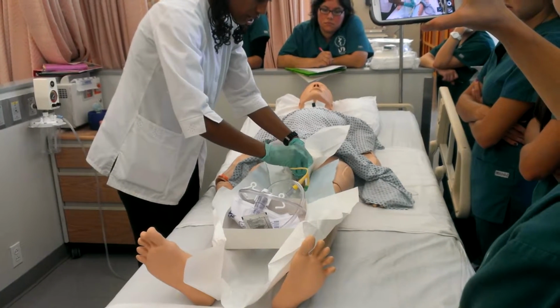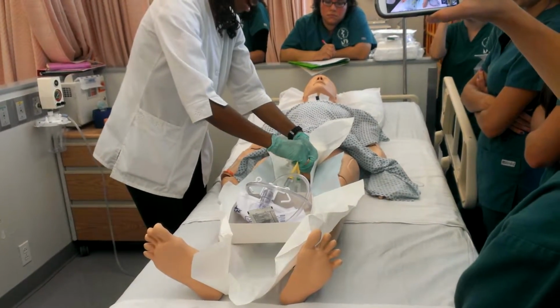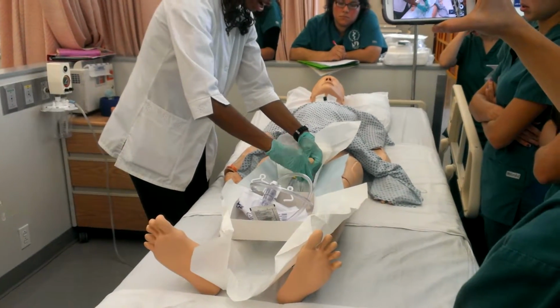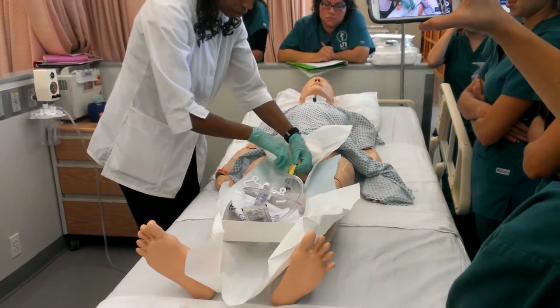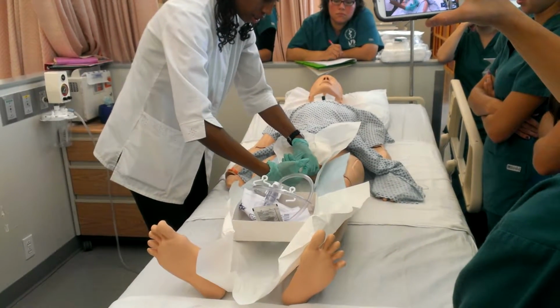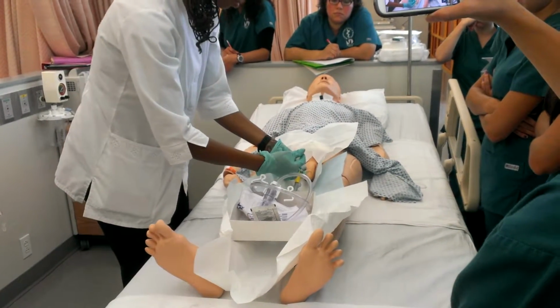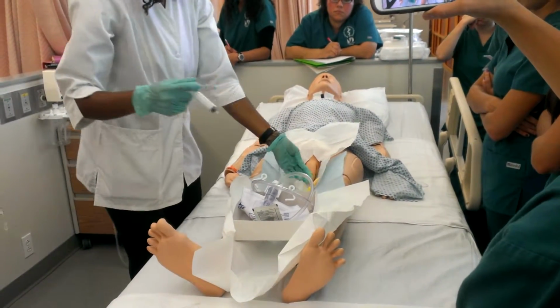And you'll start to see urine before you get to the Y. You just keep going. The man is saying, ouch, that hurts. I'm almost there. It's okay. You hold it in place, and then you anchor. After anchor, it's now in, then you pull and tug, and then that's it.